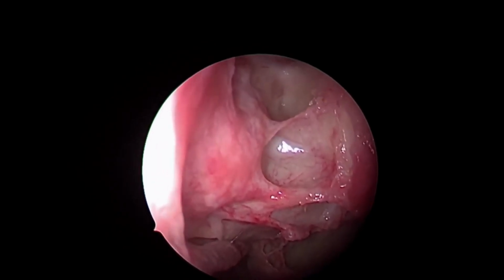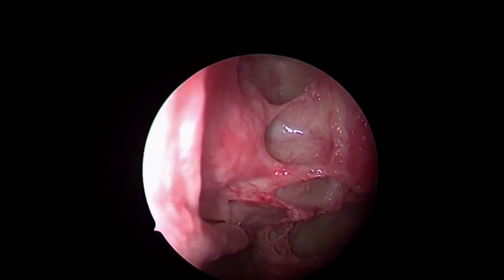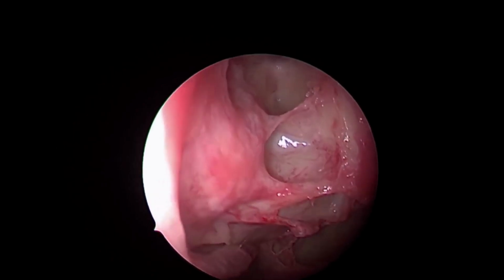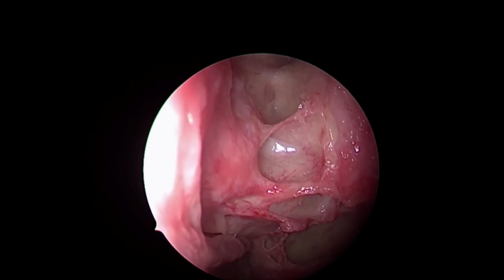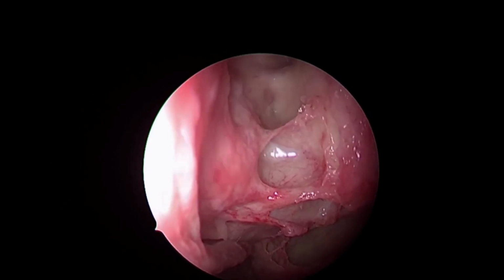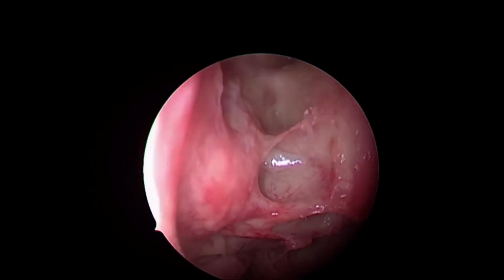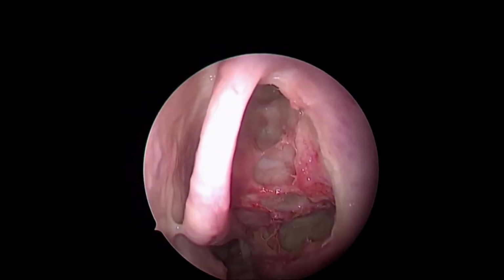If you leave bare areas for mucosalization later, they may acquire infection, a lot of crusting, granulation, fibrosis, scarring, and that ends up as a total mess, not FESS. Believe me, it is mucosal preservation which holds the concept of functional surgery, and for that the debrider is the key tool.